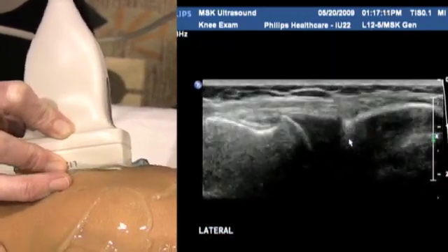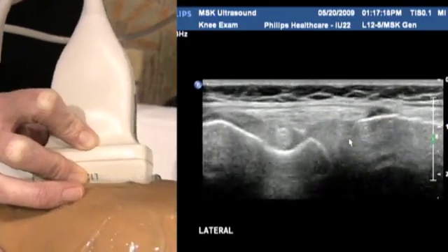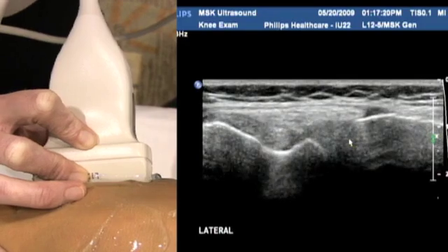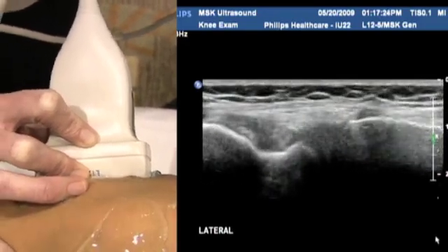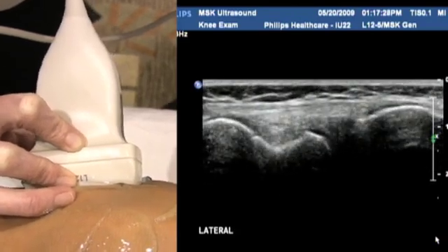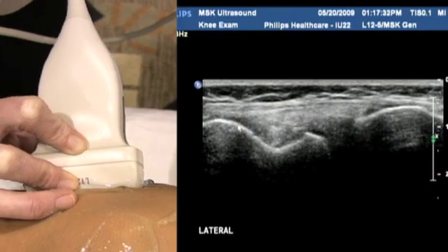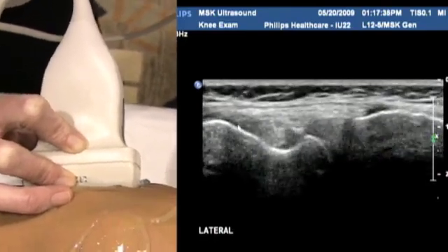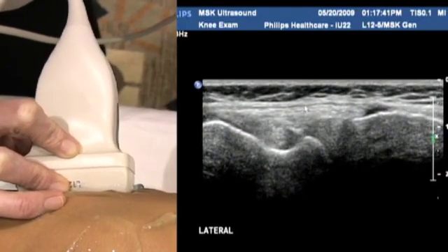Okay. So again, having a look now further afield and assessing the entire lateral knee complex, again using the entire range of the transducer, 5 centimetres I believe it is. Lying above the lateral meniscus, you see the lateral collateral ligament sits just above. Again, you're assessing that for integrity, making sure it's intact.